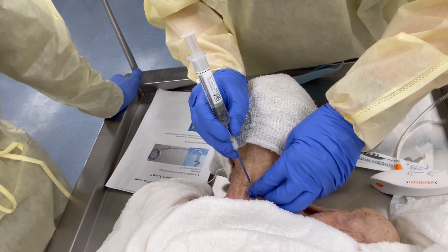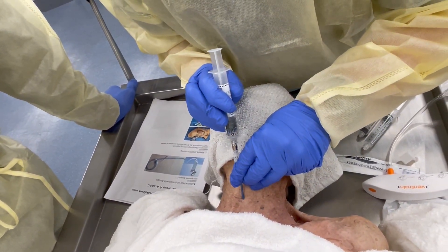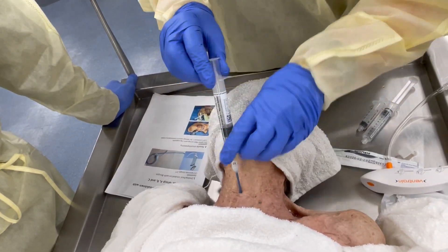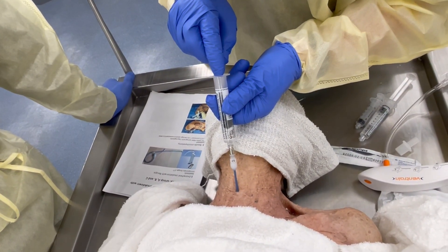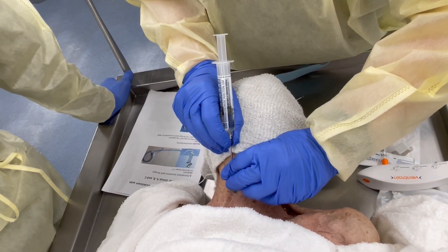I'm going to go in with this. I'm going to aspirate — got air. Pull my needle out.